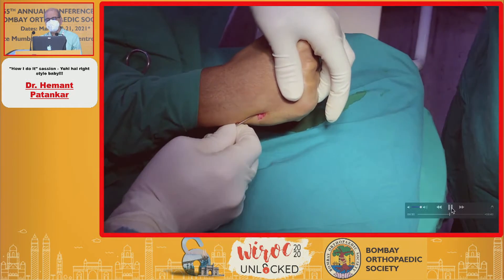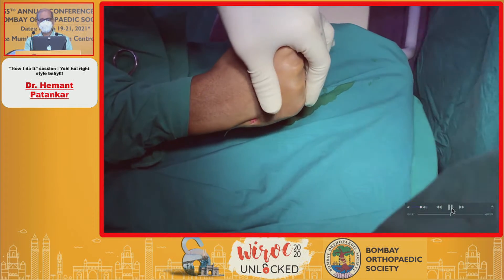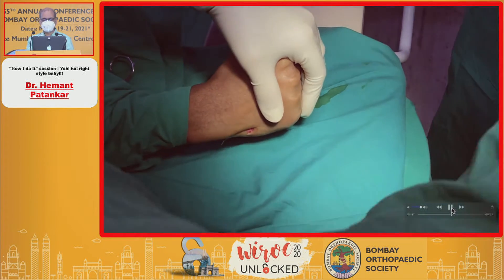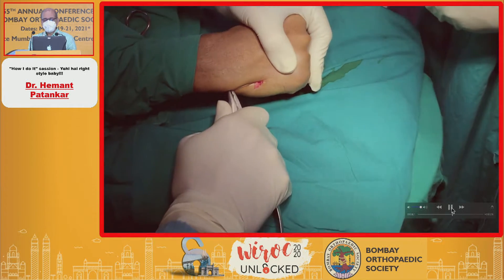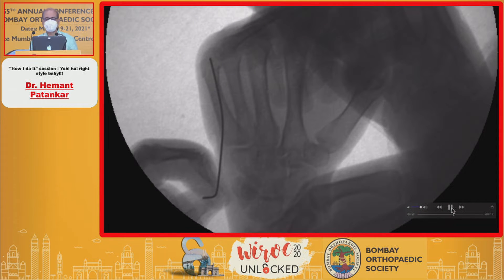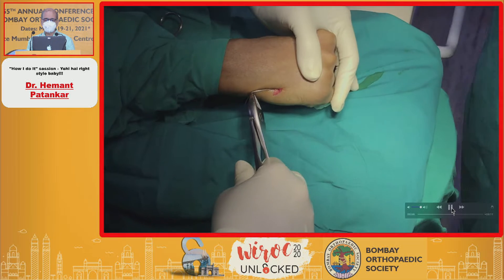You push this wire with your hand. Remember to cut it — do not keep the wire bent, otherwise it will rotate on its own while you are inserting the other wires. Using the handle, push it and impact it finally. Be satisfied with the impaction — the impaction has to be subchondral. The reason for cutting the sharp tip is so the wire does not inadvertently penetrate the articular surface.